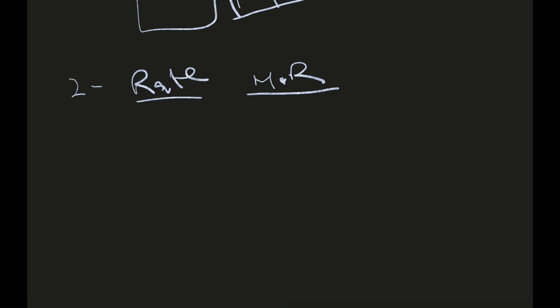Now, I want you to remember this sequence of numbers: 300, 150, 100, 75, 60, and 50. It is very easy to remember. Just remember this sequence by heart.